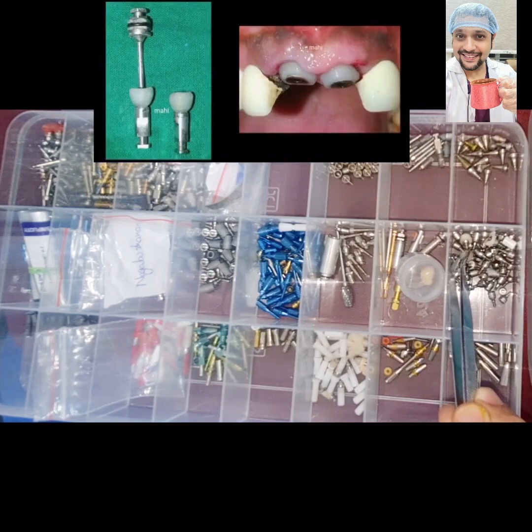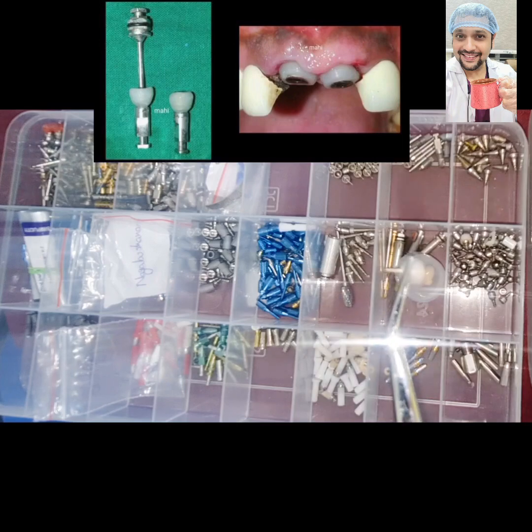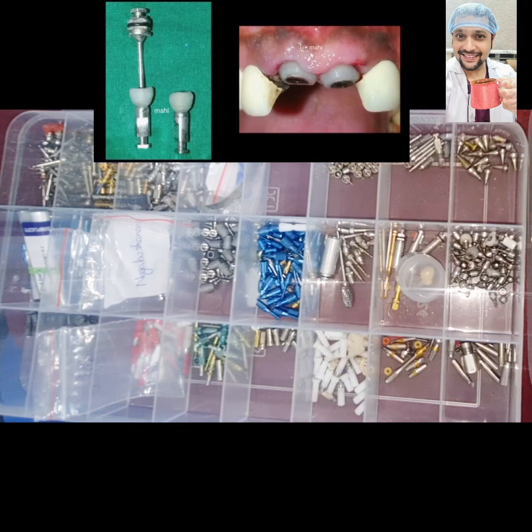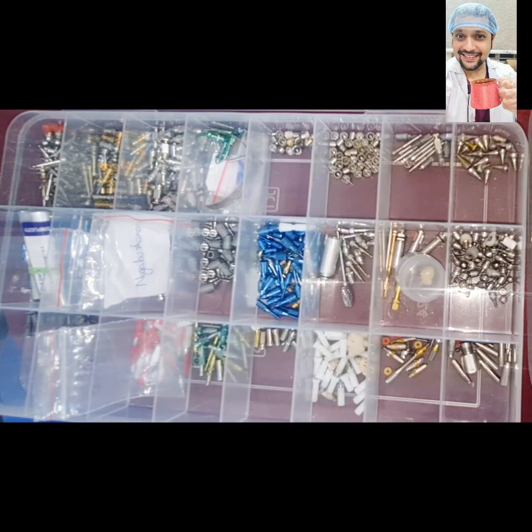You can also customize a healing abutment with composite. If you see in the picture, there is composite around the healing abutment. So you can always put composite around the healing abutment and customize it. Now, why do I need to customize? It depends on the area of the implant placement. Suppose I've placed an implant in the anterior zone, I can always place composite and shape up my emergence of the future restoration accordingly. If I want something for the molar, I can get a bigger emergence or a wider emergence by placing composite. So it is known as customization of the healing abutment with composite.